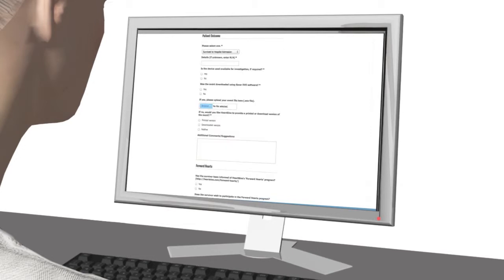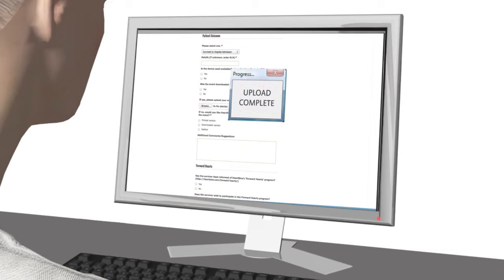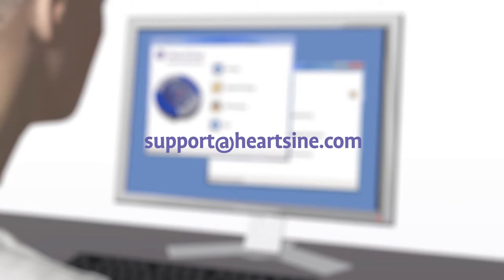After using the Samaritan PAD during a sudden cardiac arrest, submit the Saver Evo file and a completed customer event form to Heartsine. Heartsine will send you a free replacement PAD pack. After downloading the event data, please erase the data from memory. If you need assistance to do this, contact Heartsine Technical Service.